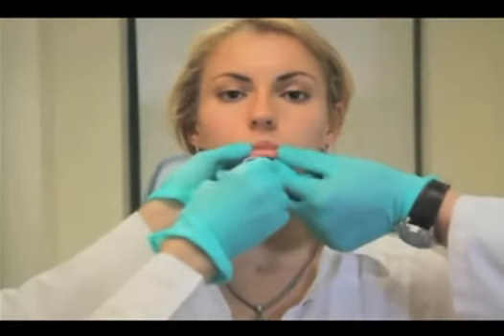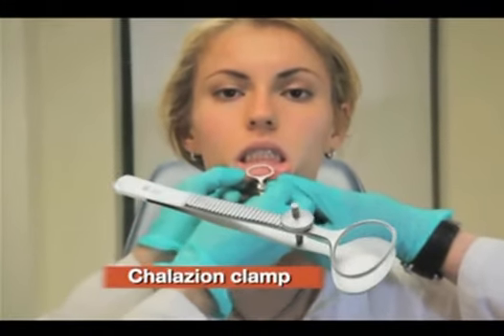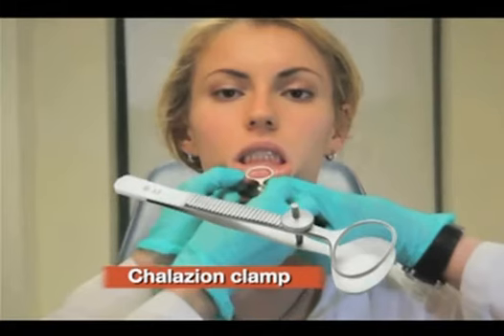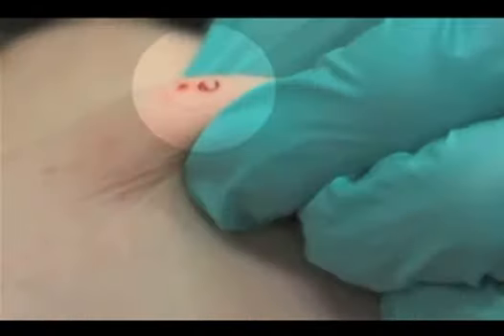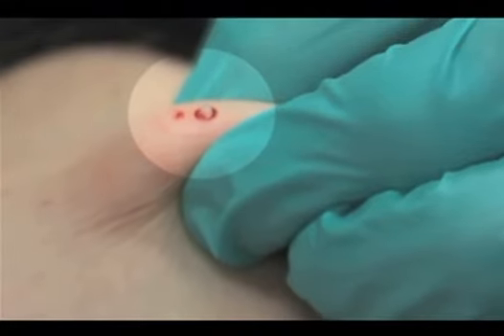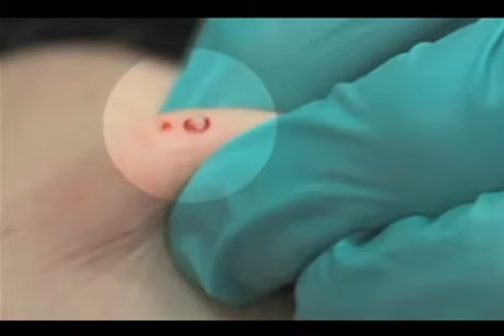When performing a biopsy on the lip, which is highly vascular and extremely pliable, use a Chalazion clamp to allow for easy handling and intraoperative hemostasis. In infants, the subcutaneous fat will push the specimen up, making it relatively easy to grab. Therefore, you will not need to punch much beyond the dermis.